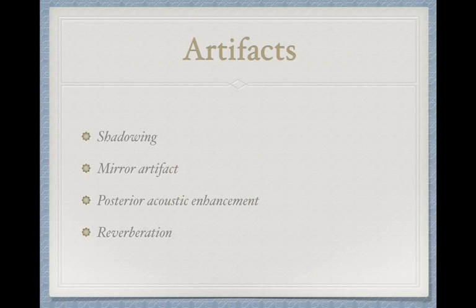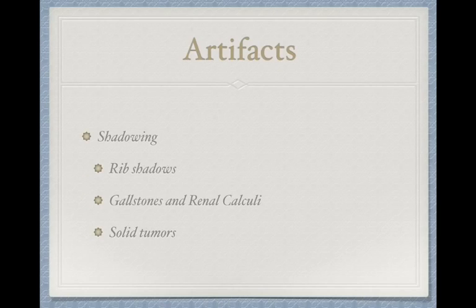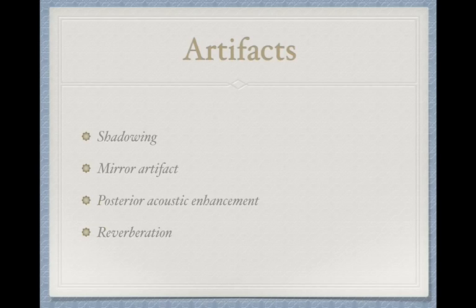All right, so the last part that's actually pretty important is artifacts. We're going to go through this somewhat quickly. So shadowing is an important artifact to review, mirror artifact as well. And then posterior acoustic enhancement we talked about a little bit off the bladder, and then reverberation.